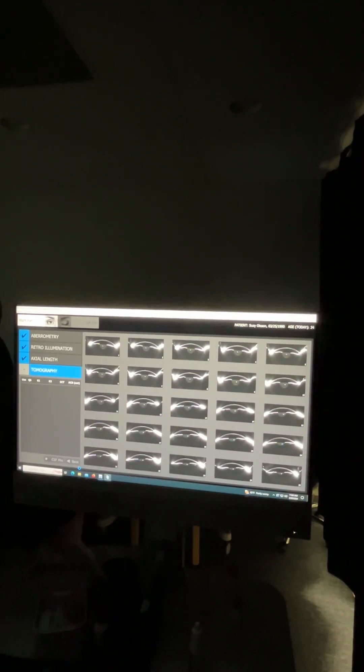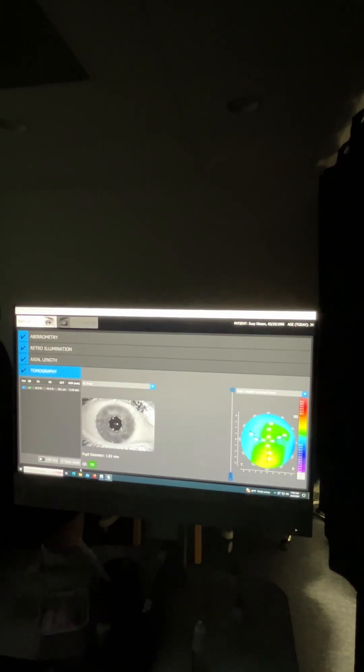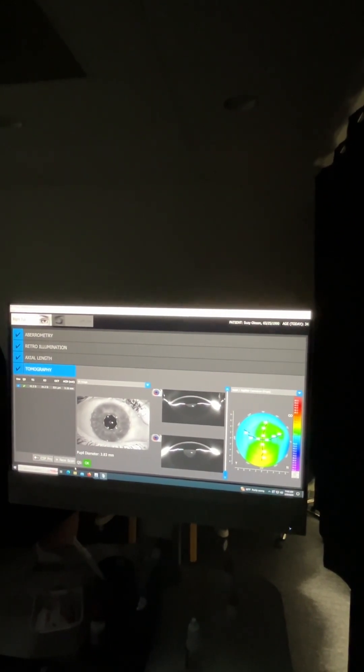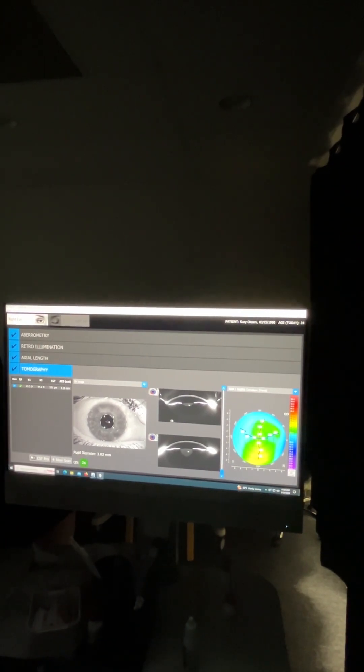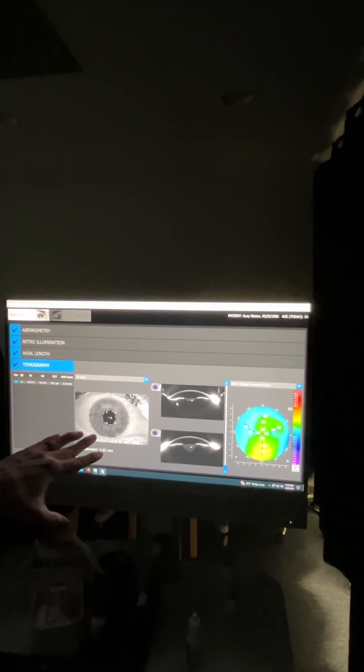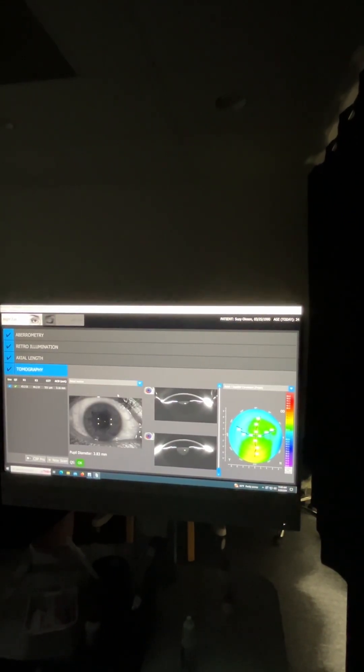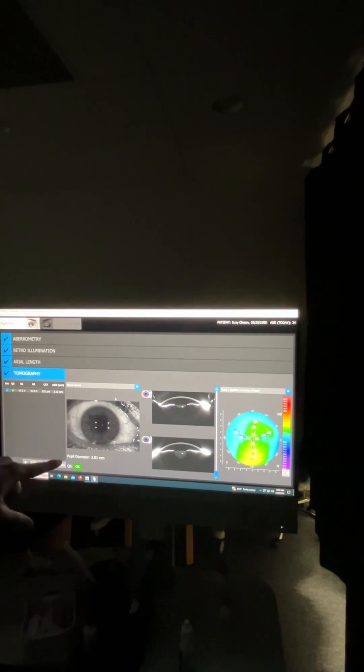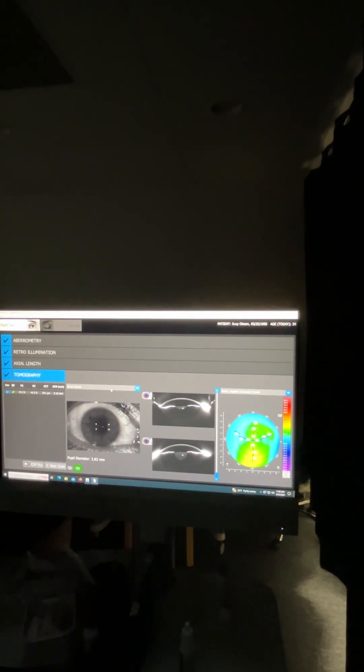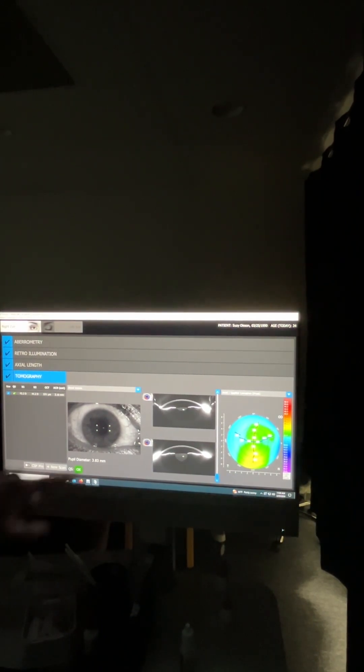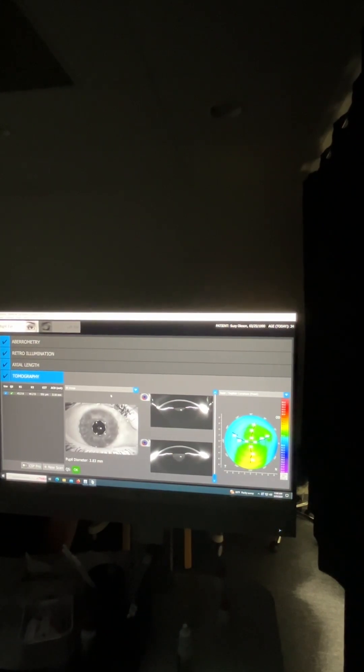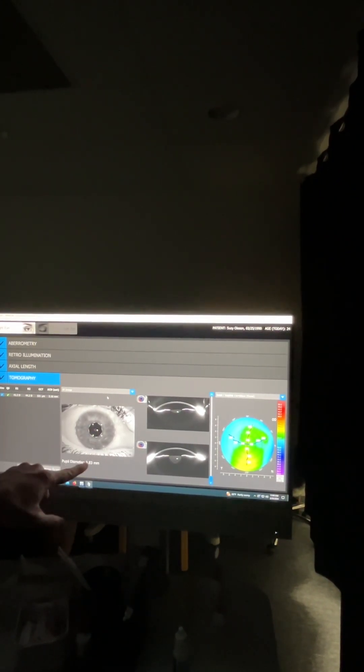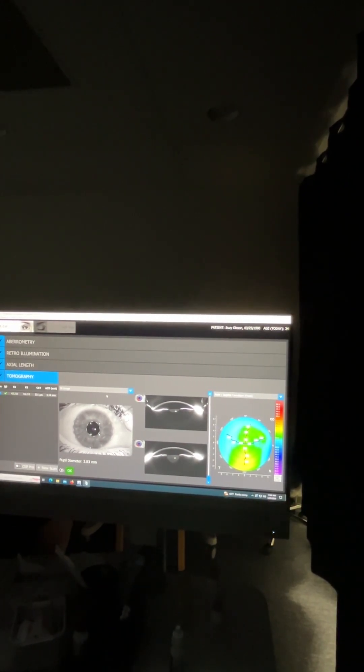And then this is our corneal tomography scan. So it's going to take 25 in this particular situation. You can set your settings to where you can actually view 50 rotating images. So it'll give you your information here. You can see basically an infrared image of the eye. You can also look at the blood vessels and you can do this on the aberrometry view as well. And this is a really nice way of essentially seeing how red or irritated or inflamed the eye might be. Susie, you can sit back if you want. The AR image here is going to get your pupil size. This is going to be more of a photopic pupil. So it's a little bit smaller than it was on the previous image.